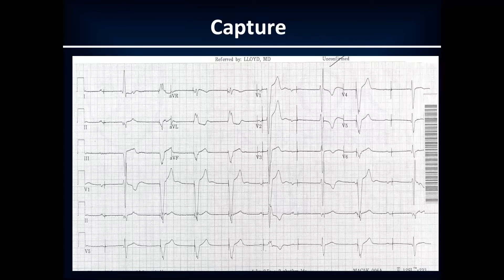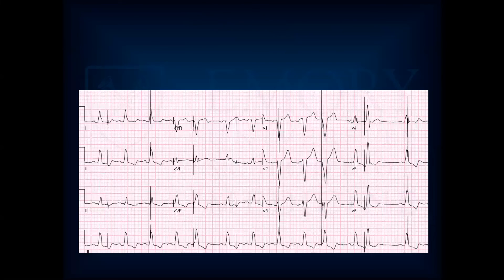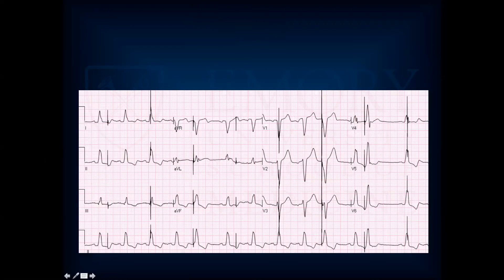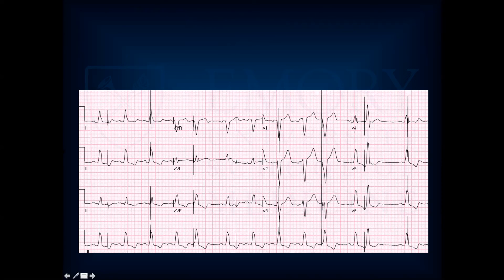Capture issues are rare — these are pacing spikes with nothing after them, representing a lead problem. Here's an example of a pacemaker intermittently capturing the ventricle and occasionally missing — this represents an output problem, either lead dislodgement or needing to increase pacing output. Remember a VOO pacer: absence of sensing can lead to functional non-capture if the V is paced in the refractory period, like on the ascending limb of the T wave. That's not the wire's problem — that's the ventricular myocytes being refractory.